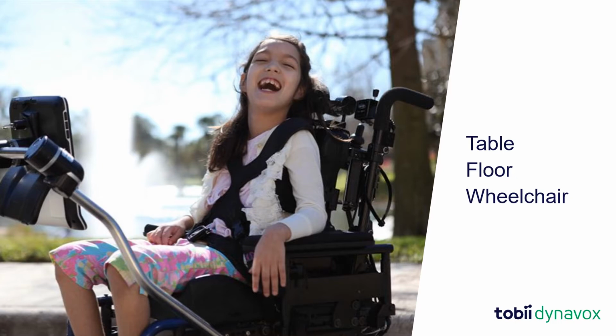Now that we understand the importance of AAC device mounting, let's look at each of the 3 primary types of mounts: table mounts, floor mounts, and wheelchair mounts.